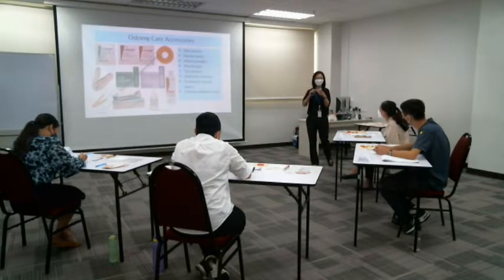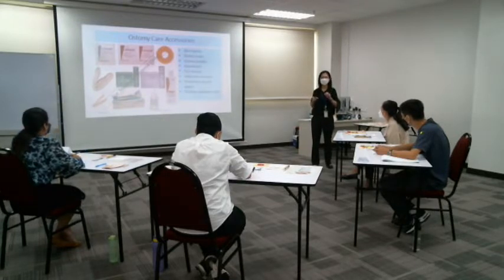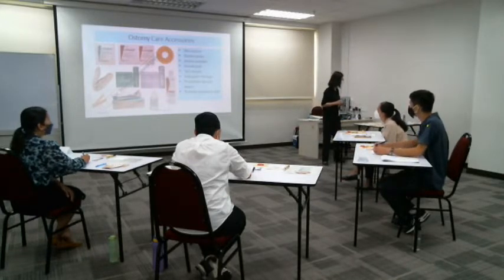It is used to put surrounding the stoma because for some patients the skin around the stoma is uneven, and when you want to fix the bag, you find it difficult to stick properly. So you may need some help. You can use the stoma paste, or the stoma ring.